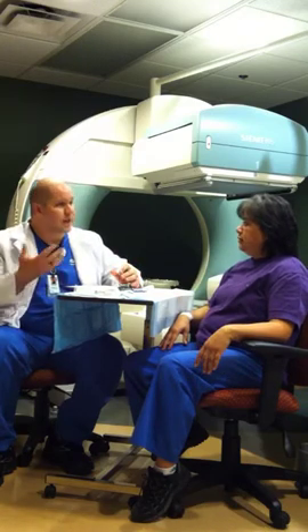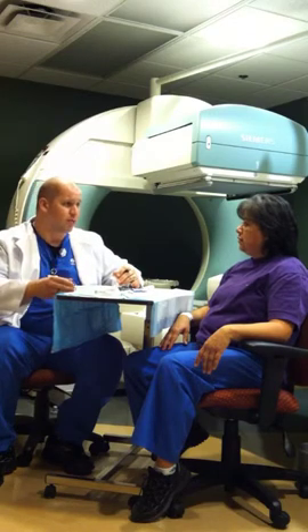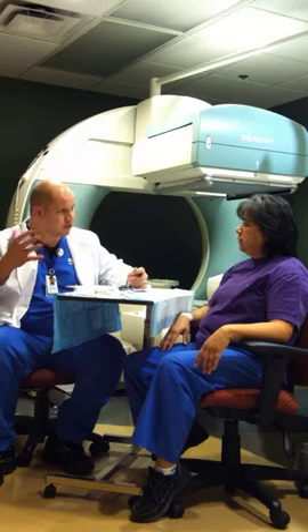So what the doctor is wanting to do is get an assessment, like a baseline, of how your heart is doing. Probably throughout your chemotherapy program, they're going to have you come back every month or a couple of months to have your heart checked again, to make sure your heart is still staying strong enough for the chemotherapy — that they're not doing too much damage to it with the chemicals they're giving you. So this is probably just going to be a baseline exam, and they're going to compare future MUGA tests and your heart readings to what we're doing today.